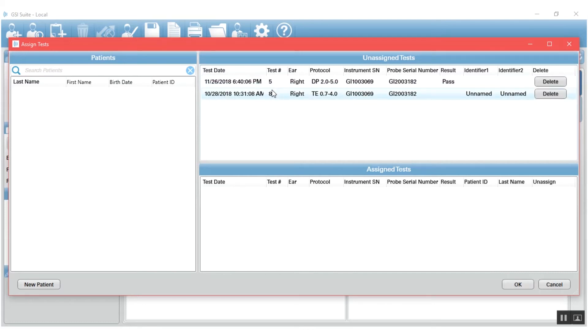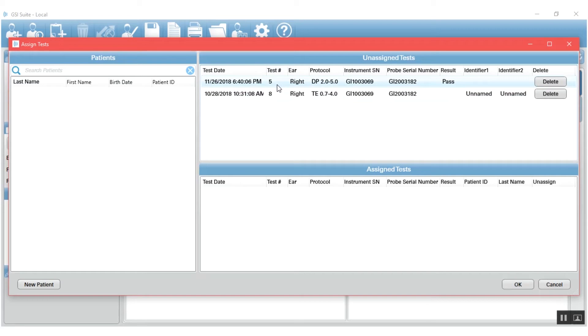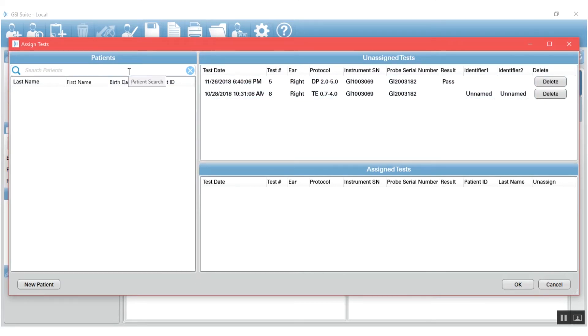If you have put in a patient list, then those patient names will be in the unassigned test area and it will be easy to find and decide which result goes with which patient. If there's no patient demographic information, you can certainly use the date and time or the test number to determine which patient each one of these results belongs to.